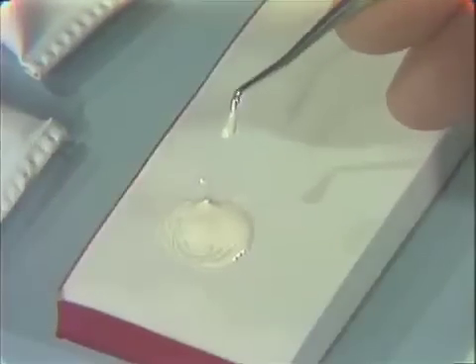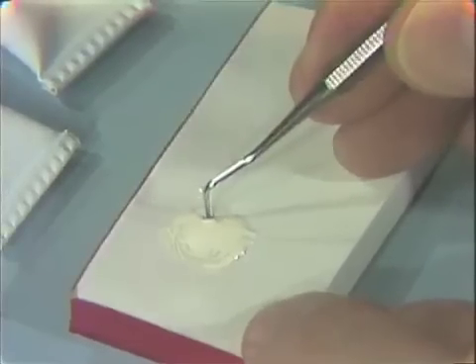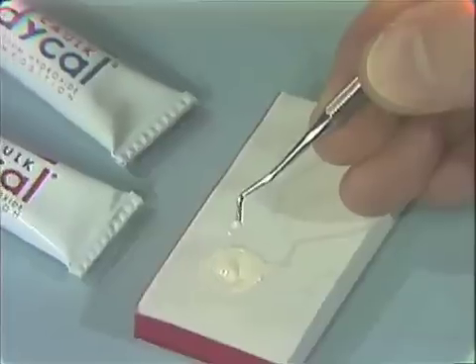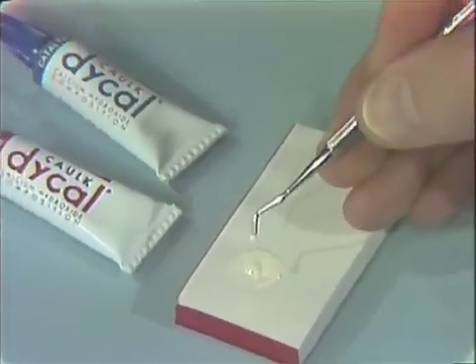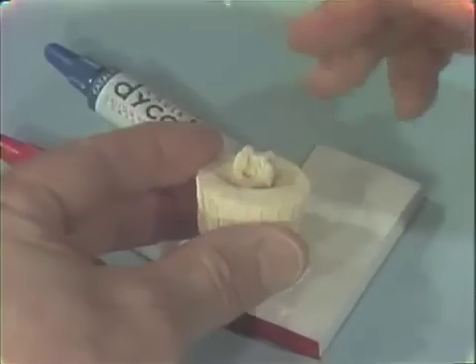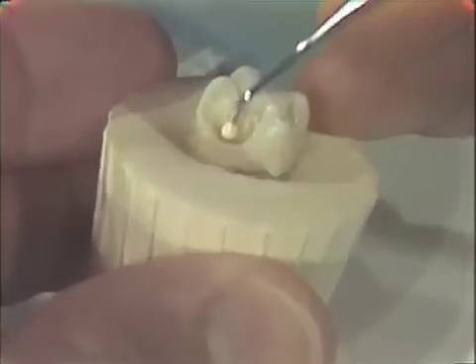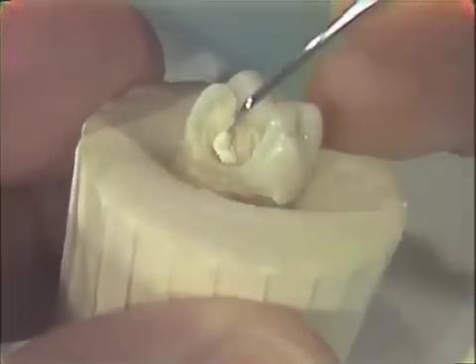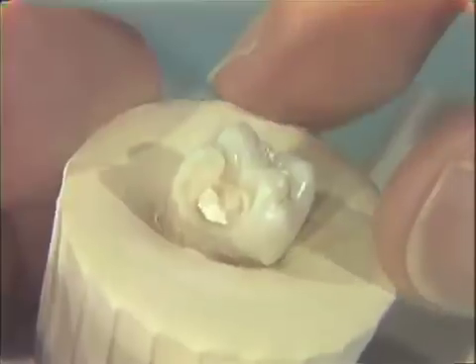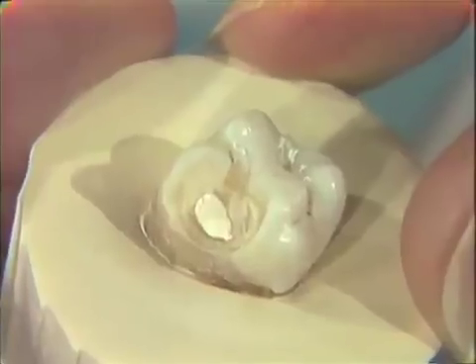The end of the instrument is wiped clean. A small portion of the material is picked up on the spoon excavator and placed into the prepared tooth. If the pulp exposure is of such a size as to permit the direct pulp capping procedure, the material would be deposited into the prepared cavity over the area of the pulp exposure and extending just beyond the lateral dentin wall.